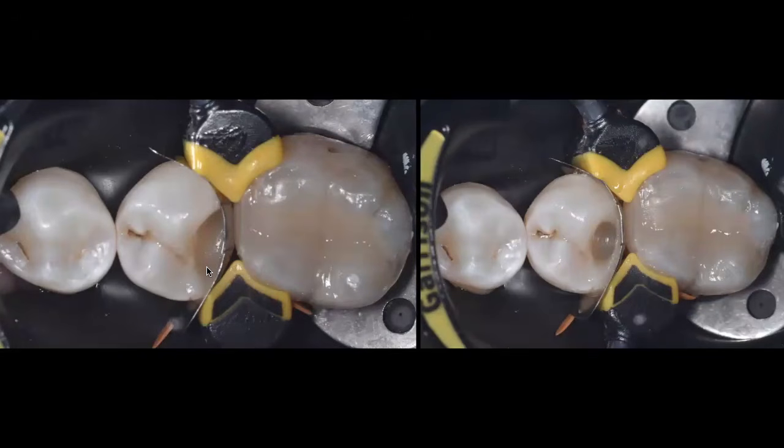Once I feel that I'm ready, that I've done enough, I go ahead and light cure, and then I come back and do my proximal wall. That's what you're seeing here. This proximal wall is the second layer right after that first horizontal layer. And I make sure again that it's adapted beautifully to my buccal and my lingual walls. That enamel in that area was, for a reason, beveled. This is the reason why we want ideal adaptation.